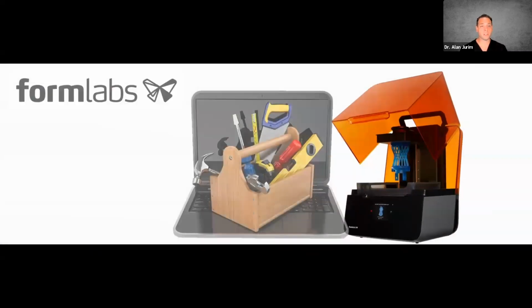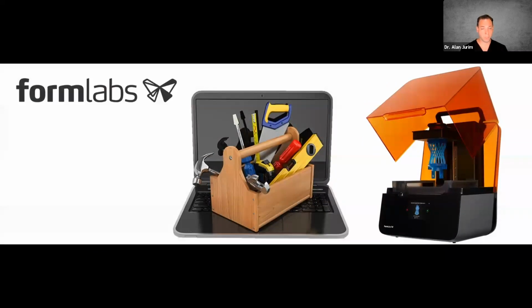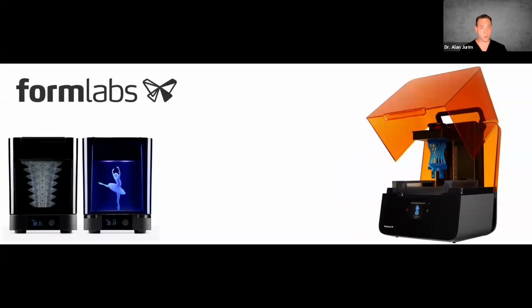So Formlabs, and what we see here is the Form 3B printer. It's one of the key tools in our digital dental toolbox. And what's really important to understand when we talk about 3D printing, and I've had experience with this, unfortunately, is that the entire package is where you find the value within it, right? So we talk about the package and we talk about really the platform. It's not just the printer, it's the post-processing, and it's the connection of the post-processing with the materials.